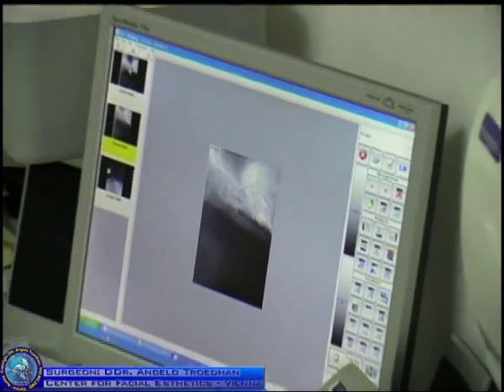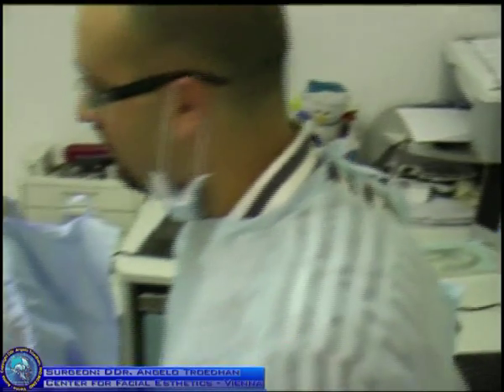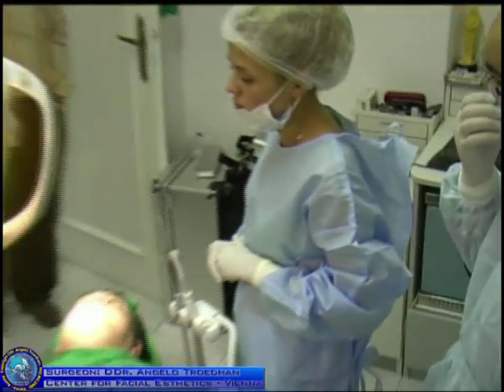Approximately 8 mm high. And in this case it is also sufficient for the last implant that we are going to put now. So once again it's the typical pleasure dome intralift. Because it looks like a dome.